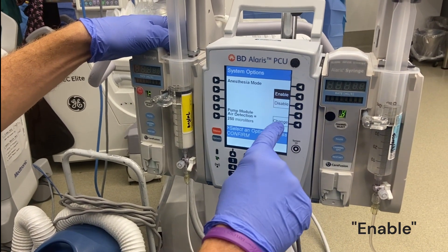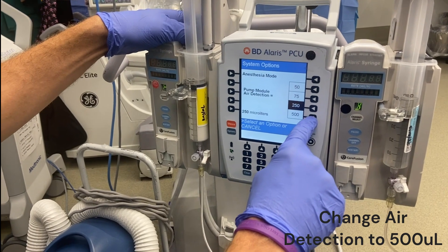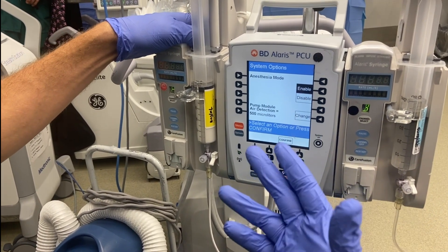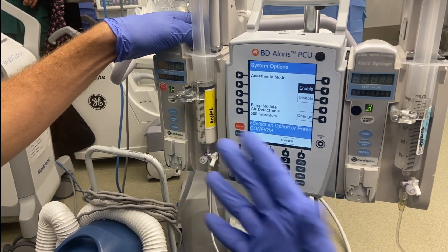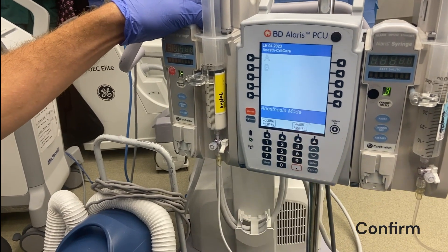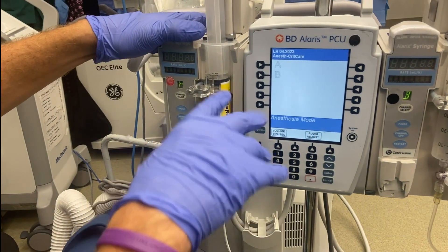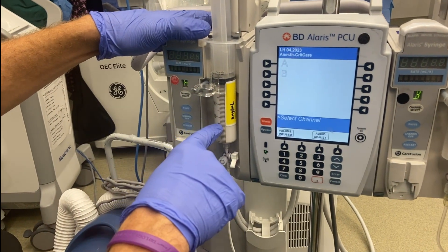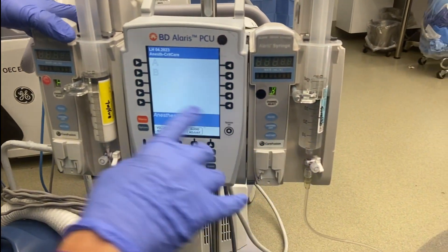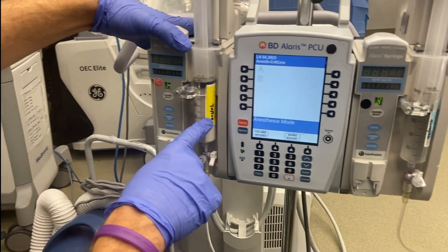Then I'm going to change this here to 500 microliters. That's going to allow it to not alarm as much with air. Now I'm going to go to confirm. We've got propofol here and remifentanil over here.